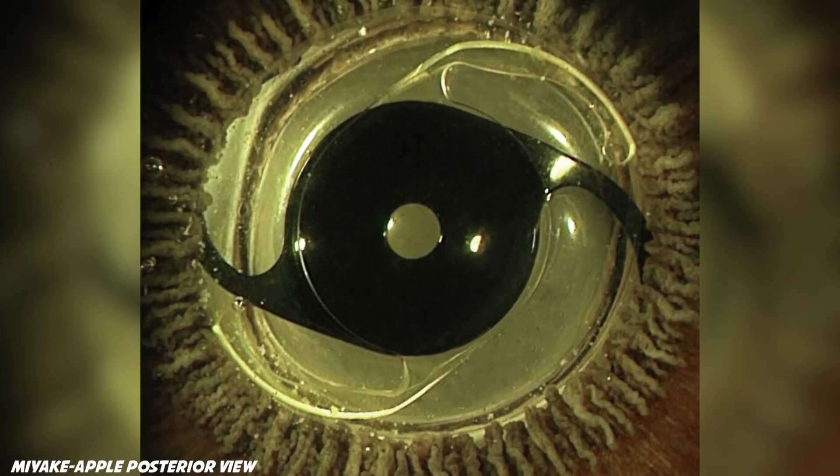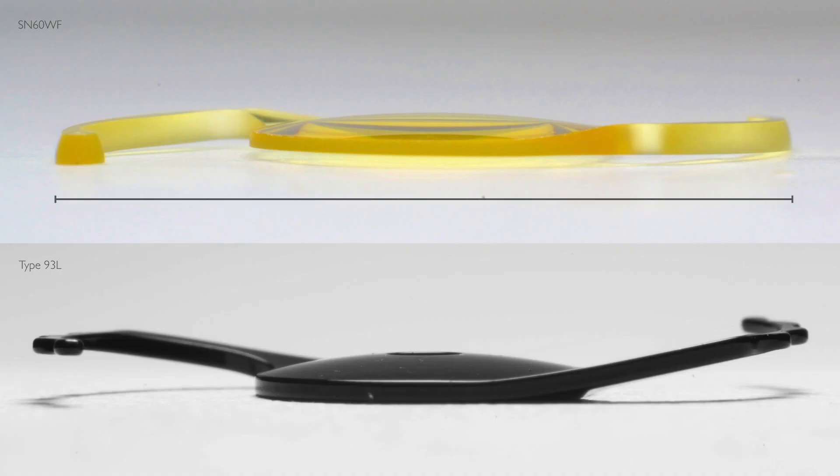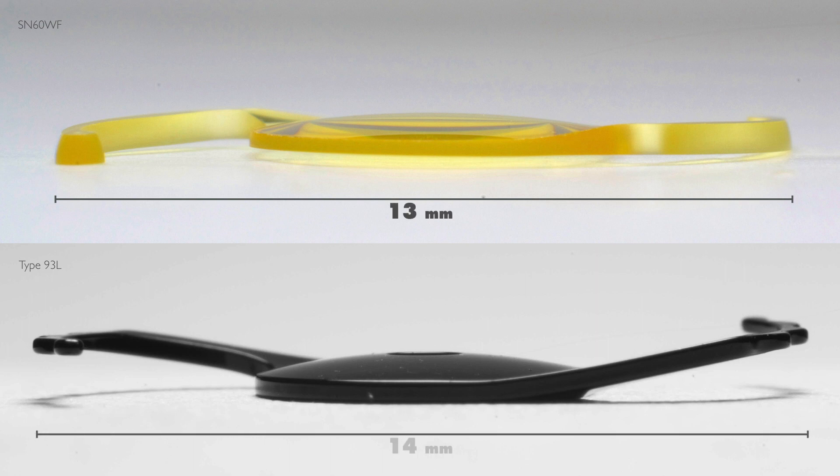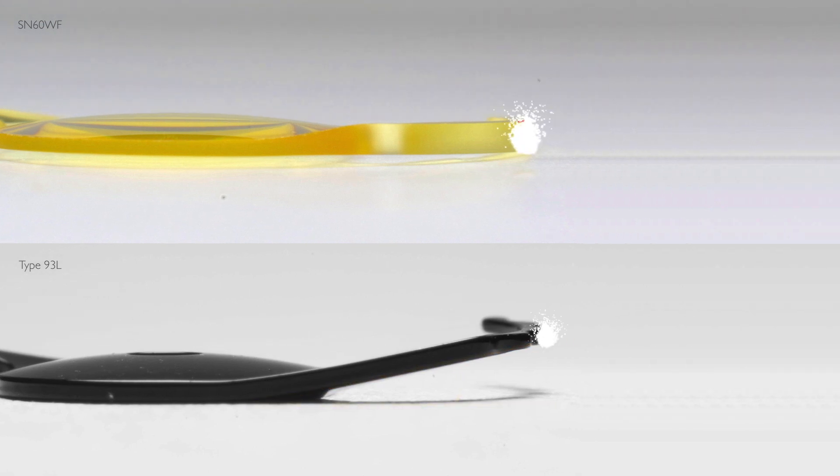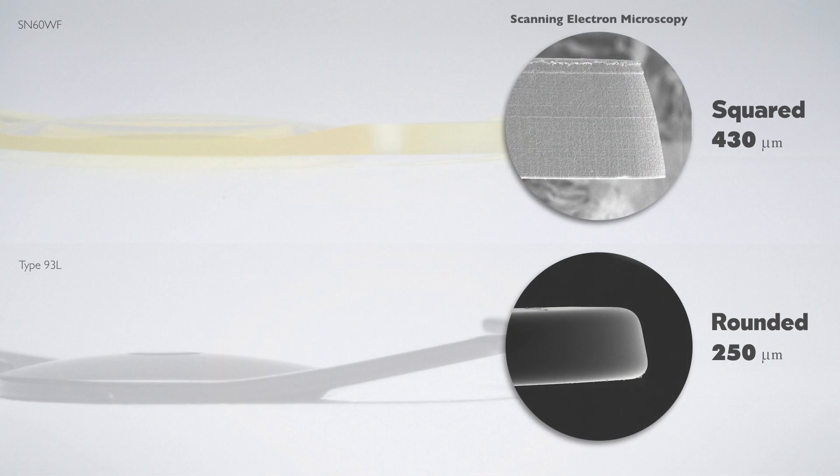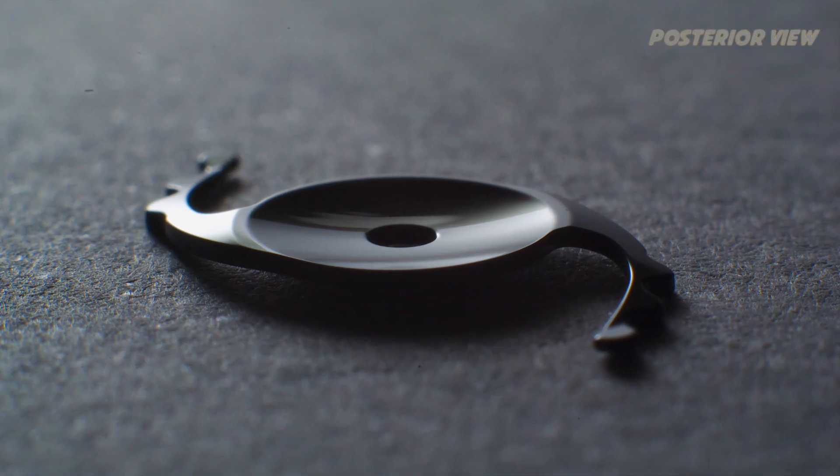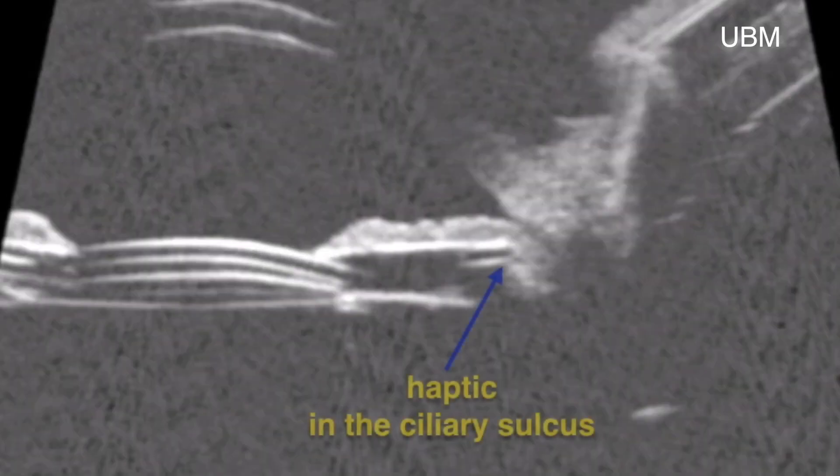So, to avoid such complications, this device has very specific characteristics for sulcus implantation, such as a larger overall diameter, angulated haptics, with a thin, rounded and polished profile. The occlusive portion has a concave-convex design, to avoid contact with the primary IOL.